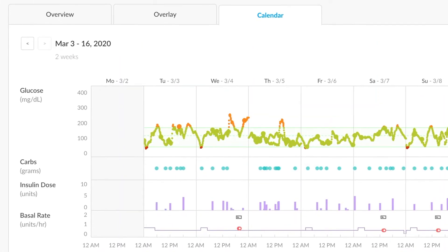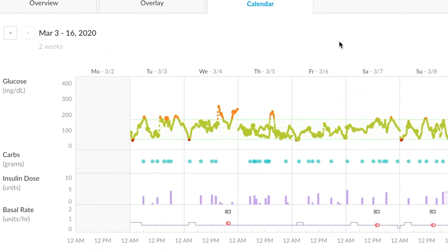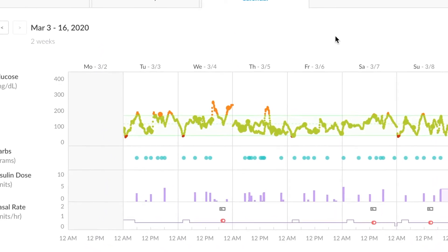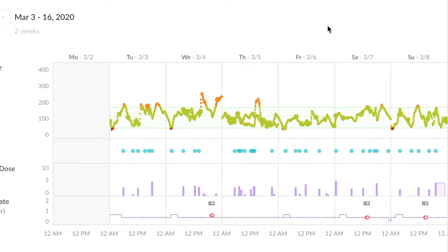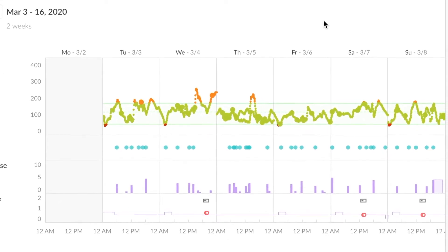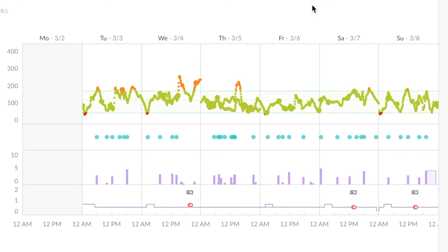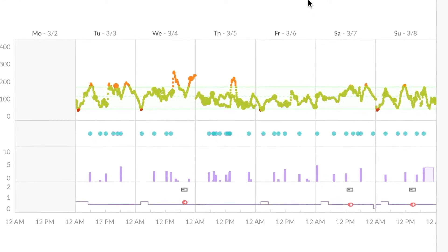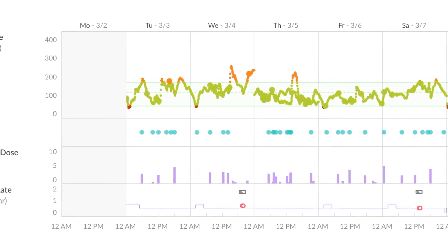Moving to the graphs calendar view consolidates all data from all the sources that have been uploaded to the patient account. So BG values, pump values, CGM values, they'd all be represented here.